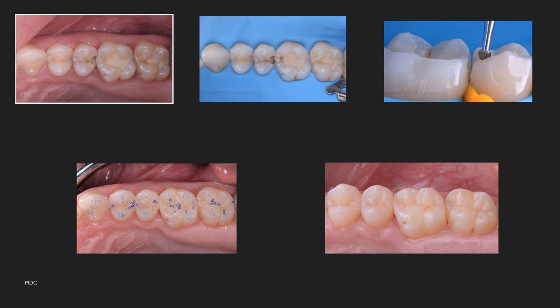After the proximal wall is restored, the occlusal morphology is created following the anatomy of the tooth. Once the build-up is complete, proceed to finishing and polishing. Avoid building composite too high as excess will require extra trimming. Finishing is done using a fine-grit bur to carve the occlusal anatomy. Occlusal check is performed using articulating paper in both static and dynamic positions. If there are no high points, polish using polishing stones, white stones, or the Soflex system.